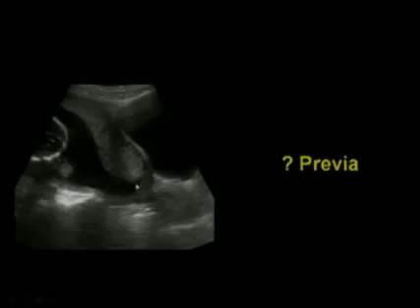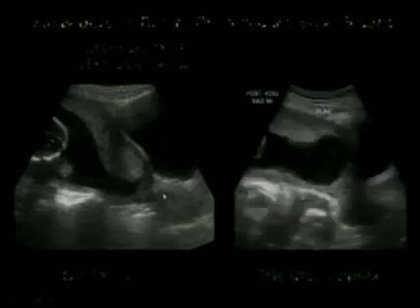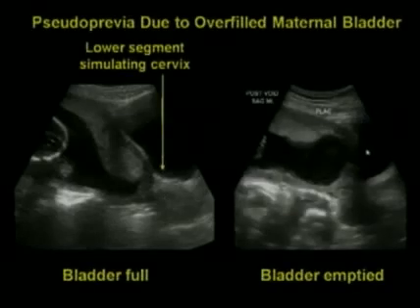The reason that you have to be very careful here that you're not making a mistake is that the bladder is extremely full. And if the bladder is extremely full, maybe this is not all the cervix, maybe some of this is the uterus pressed together. So what do we do? We have the woman partially empty her bladder, and when that's done, here we've gone to a partially empty bladder, and now you can see the placenta, which ends right around here, is well away from the cervix. There's no previa. So this image you could call a pseudo-previa or pseudo-placenta previa due to an overfilled maternal bladder.